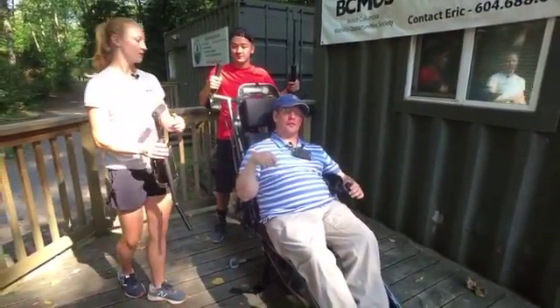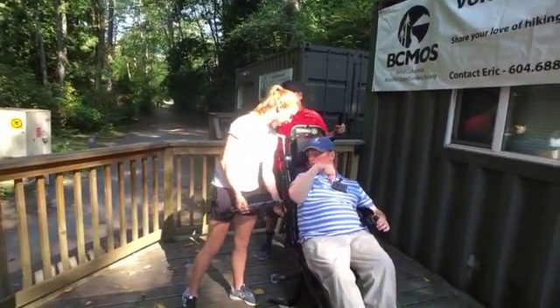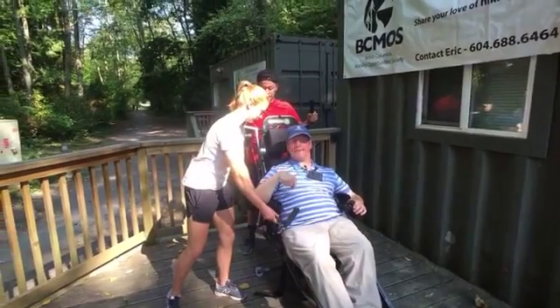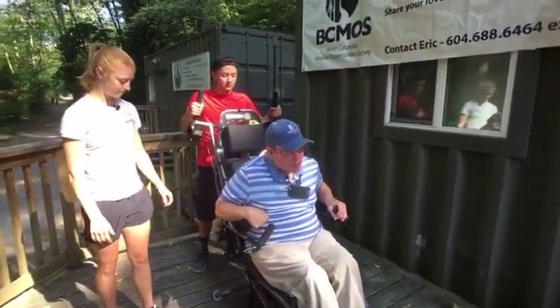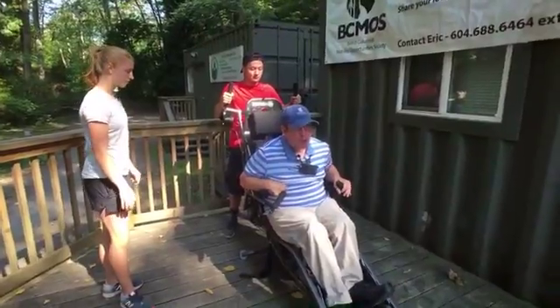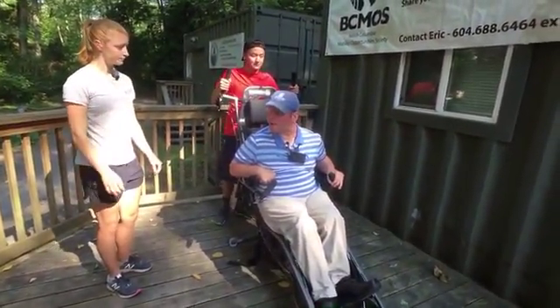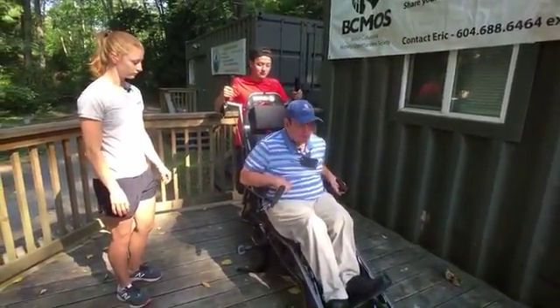But so for today, we'll just head straight down the trail behind us here, across the road and down to a little bog. So as we get going, you'll see that. But the great thing about this hike is it's a great way to try out the Trailrider for the first time. It's got a lot of trees, but the paths are pretty smooth. So it's a great first-time hike for the rider and the volunteer. So you can kind of build up to what you want to get comfortable with.